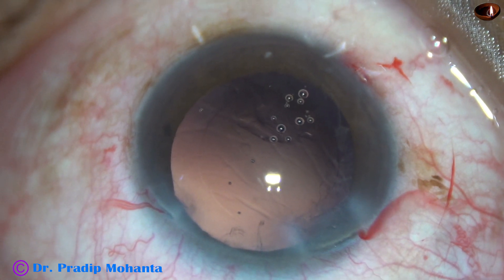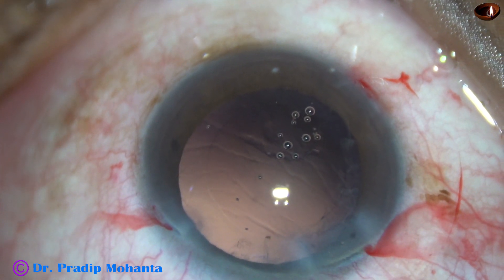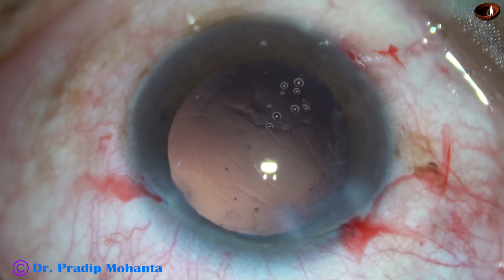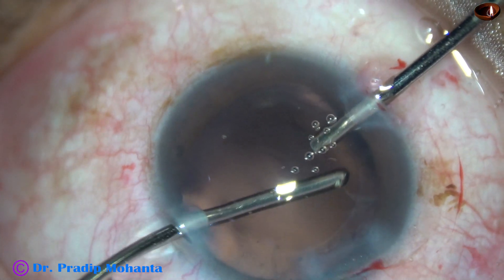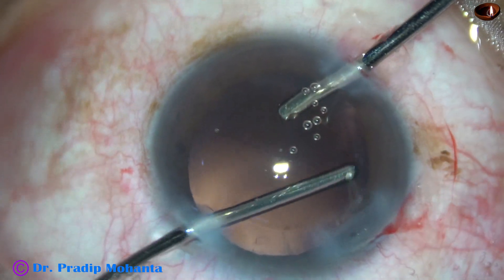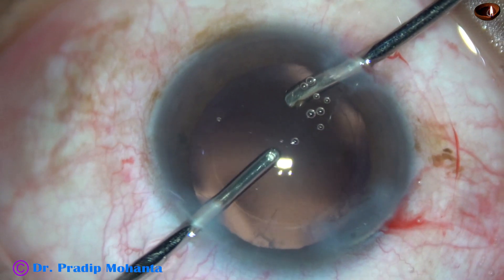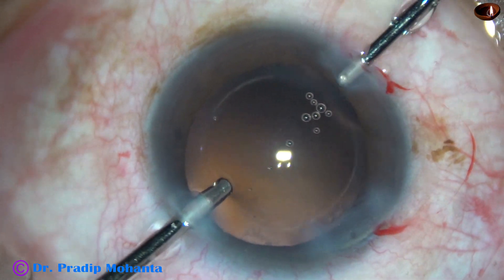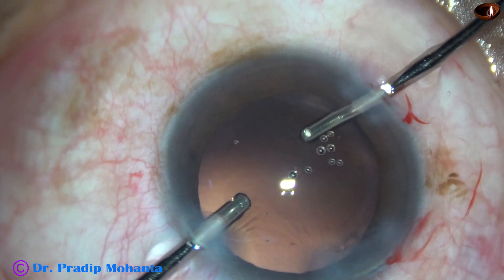Now I am going to use bimanual irrigation-aspiration for removal of cortex from the upper part, from 8 o'clock to 3 o'clock. Irrigation is from the right side port, aspirating from the left. I am removing the cortex from 10 o'clock and 9 o'clock, now the cortex from 11 o'clock and 12 o'clock. The 1 o'clock cortex didn't come, so I am going to change hands and remove the cortex from 1 o'clock. Now cortical cleanup is complete.